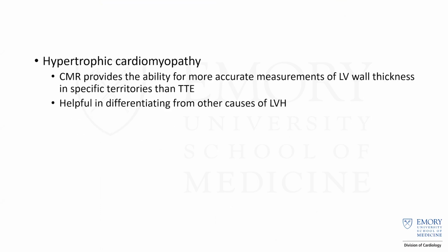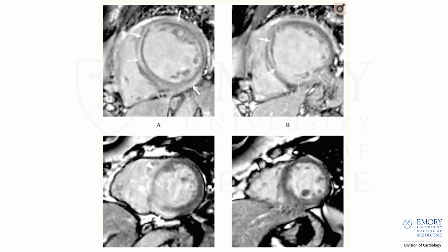This is looking at the gadolinium, I'm sorry, for a sarcoid patient. So you see these basal septum segments have a lot of gadolinium enhancement, which is what we typically see.